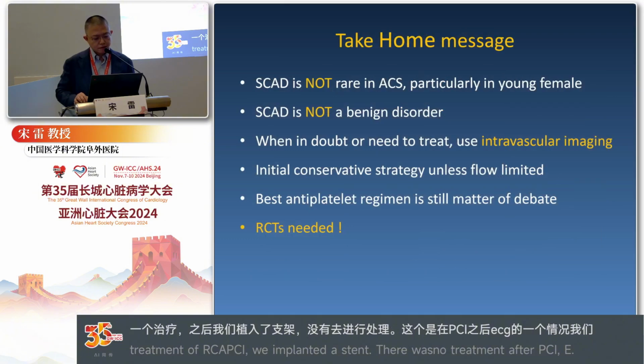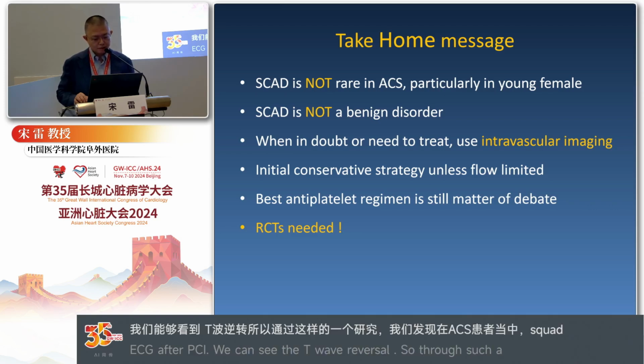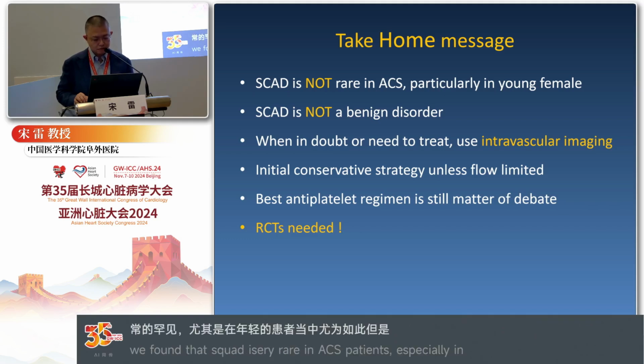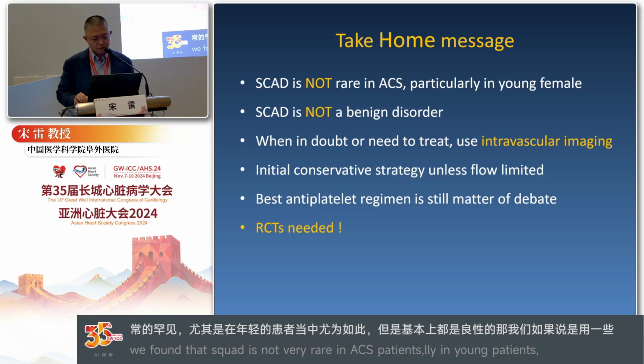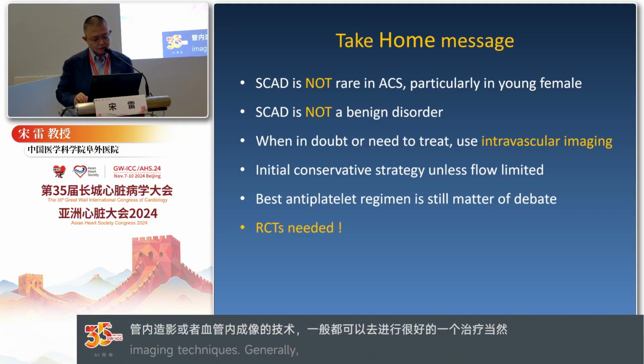For this case, we believe that SCAD is not rare in ACS, particularly in young females, and SCAD is not a benign disorder all the time. When in doubt or when treatment is needed, use intravascular imaging. Use an initial conservative strategy unless flow is limited. The best antiplatelet regimen is still a matter of debate, and I believe an RCT is needed.